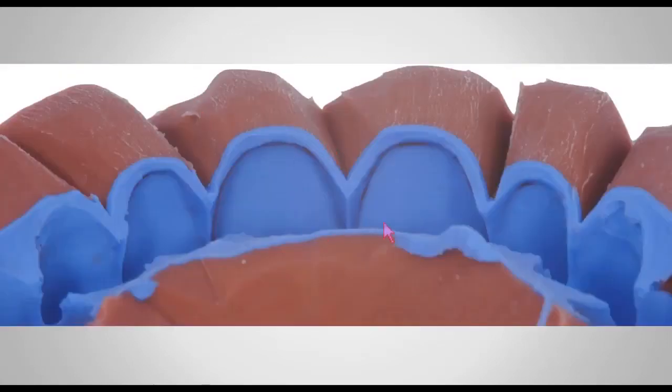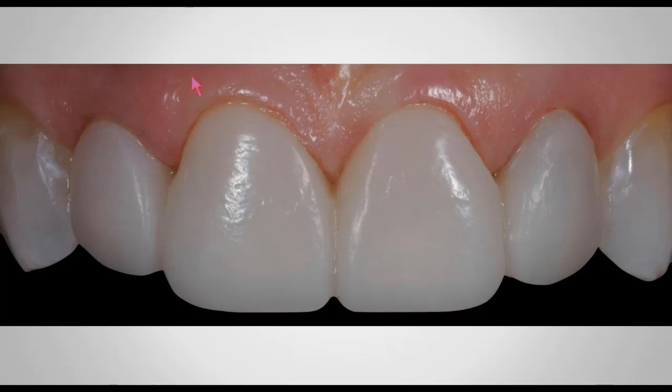And now I have this other putty matrix that I use to fabricate my temporaries. In this particular case, for my temporaries, I use exactly the same technique as if it was for the prototype. The only difference is that I use the Reprosil material, and then I use a light material to copy every single detail of my wax up. And then I inject, and I spot etch the tooth. I add a little bit of adhesive, this time only on the area that I spot etch, because I want to remove these temporaries easily.